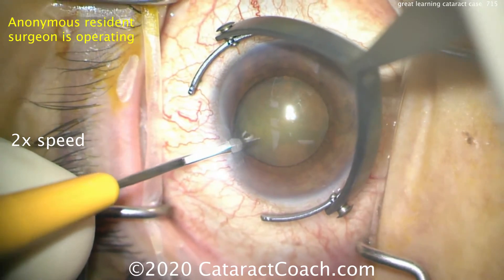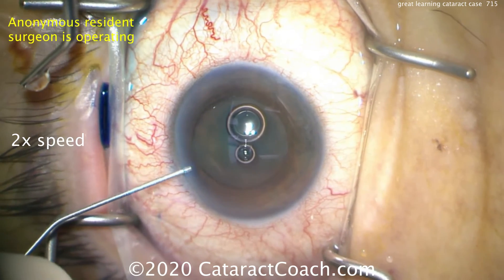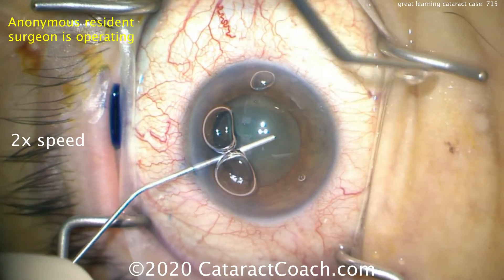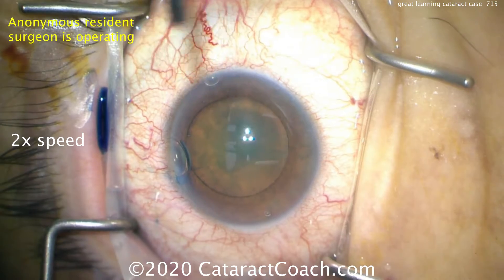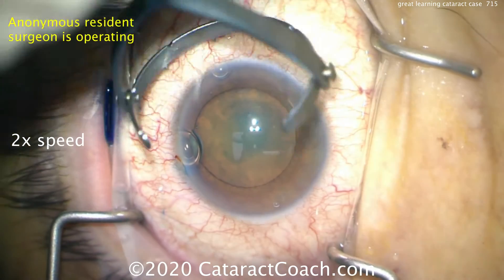We have an anonymous resident who's operating. This resident only has about 40 cases under his belt. The capsule has been stained with trypan blue dye, getting a good fill of viscoelastic — a nice deep fill there. That 19-gauge squirt bottle cannula, that's me instructing the doctor.